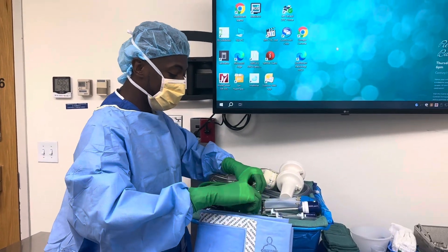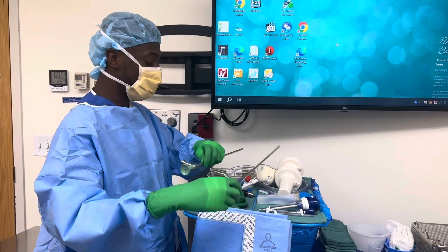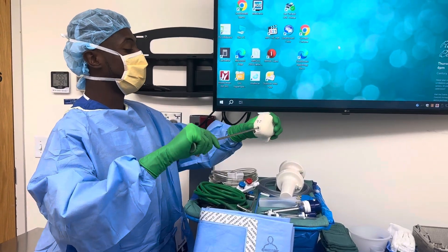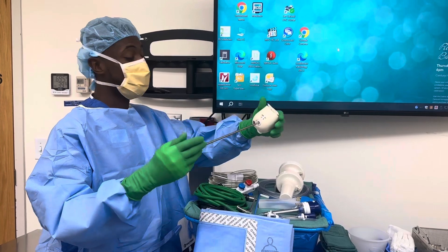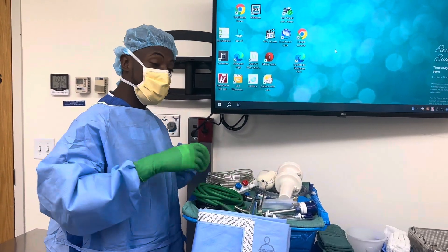We also have a 30-degree scope. He uses the zero to get into the abdomen and then switches over to the 30. The zero I put in the igloo because it keeps it warm — some people call it a doghouse — we put it in there so that when we put it in the abdomen it doesn't fog up.